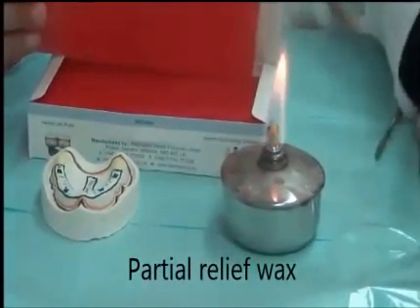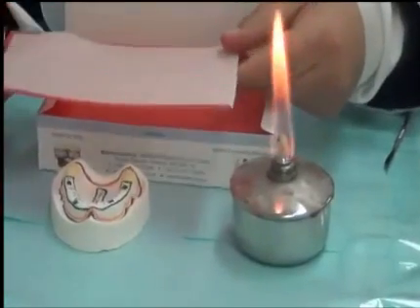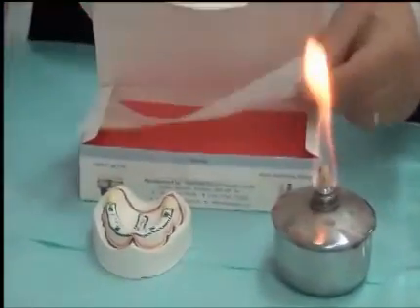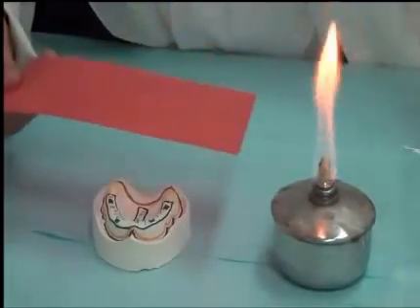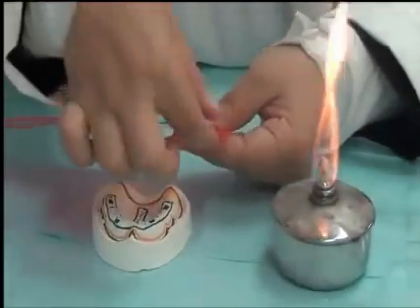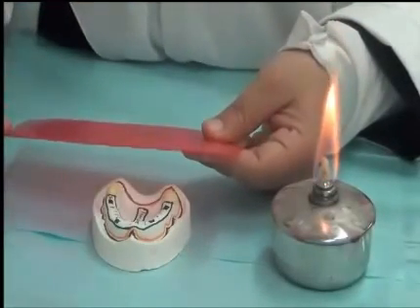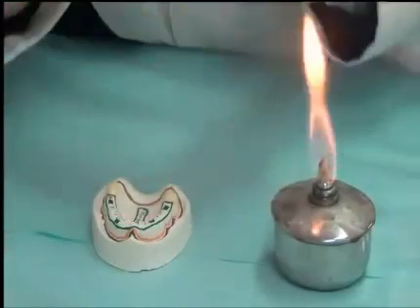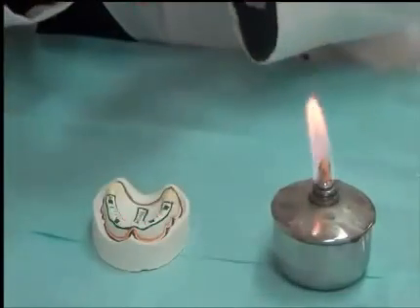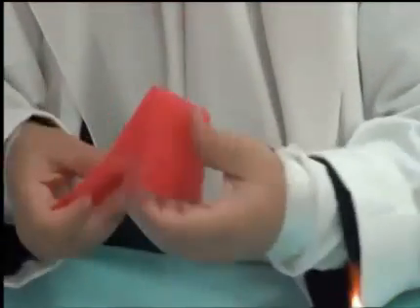We're going to use a wax that has a known thickness. Base plate wax comes in boxes, and it's usually thin coated. This wax has a uniform thickness of 1.3 to 1.5 millimeters, so we're going to use this as our spacer. We're going to do one for the upper, so we're going to cut enough material for the upper.